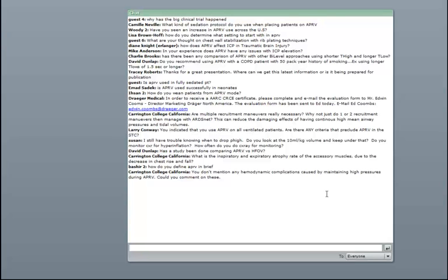Now, there's a question about APRV and COPD, and I would tell you that as a general rule, this is most suited for acute restrictive lung disease. I actually use APRV on COPD patients, but that's a whole other discussion, not focused on what we talked about today, and the settings would in fact be different for the COPD patients. But it piggybacks on a lot of the work looking at CPAP, inspiratory muscle fatigue, inspiratory muscle unloading, getting the COPD patient to use their expiratory muscles to actively exhale, and basically setting your P high to deal with intrinsic PEEP or to decrease the dynamic hyperinflation they have.